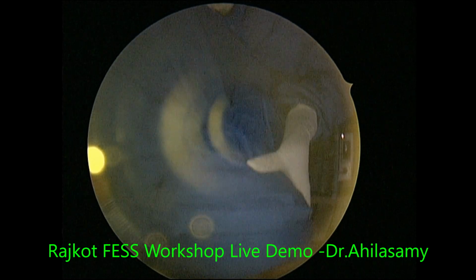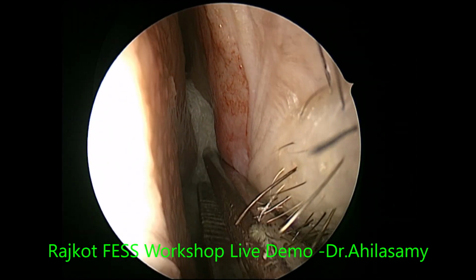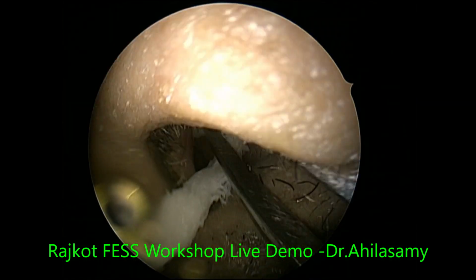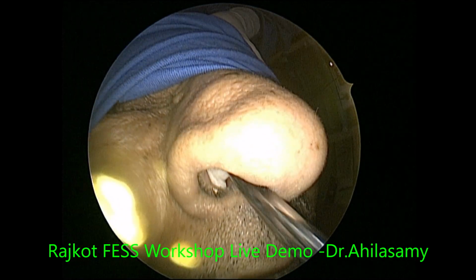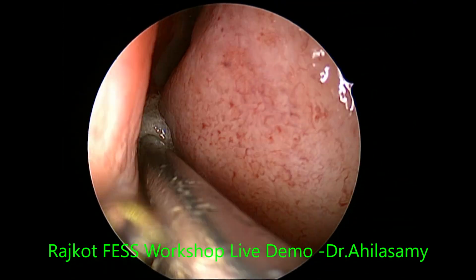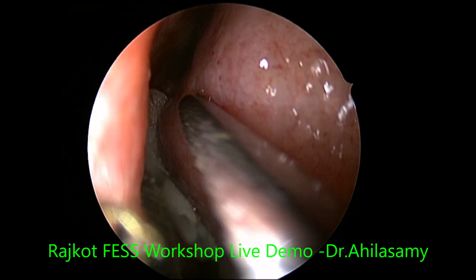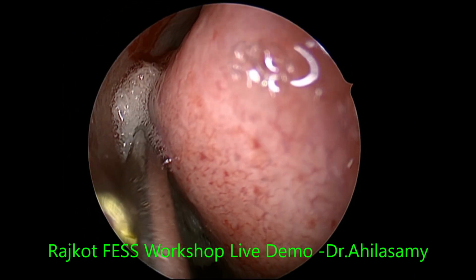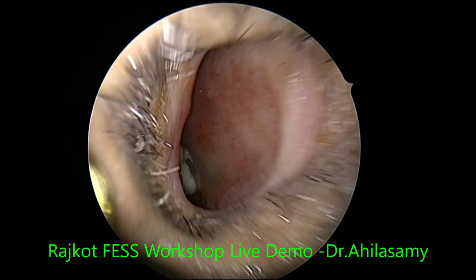This is an unedited live surgical demonstration video. In between, the voice didn't get recorded, so I am giving the voice now externally in the middle part, from the 19th minute to the 37th minute of the 51-minute video. So from minute 19 to minute 37 of the live demo, the voice was not recorded, so I am now giving the voice externally.